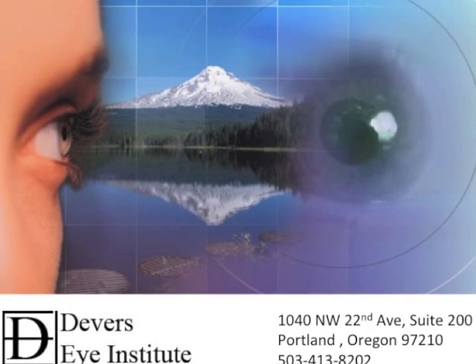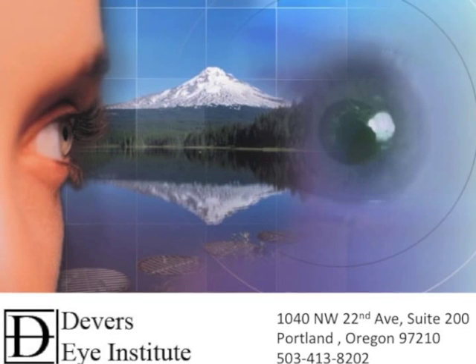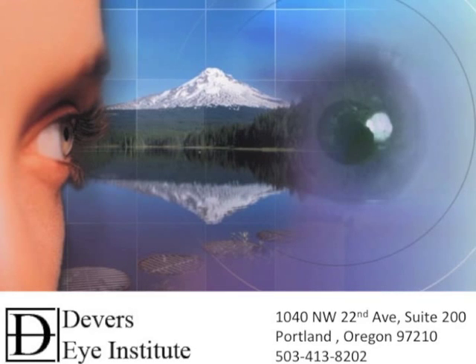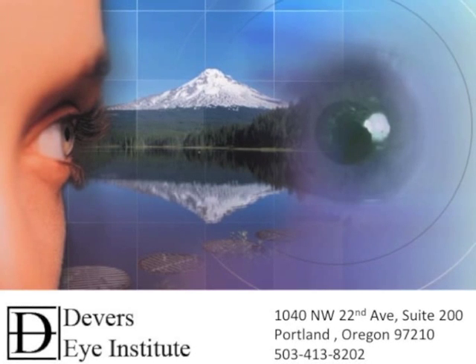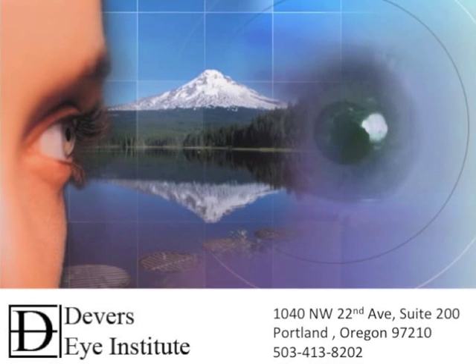Hi, this is Mike Stryko with the cornea service of the Devers Eye Institute in Portland, Oregon. I want to show you a case of a recent DMEK combined with FACO that I did. It highlights some of my recent technique changes that have allowed us to achieve a less than 4% rebubble rate that we're quite excited about and would like to share with the rest of the cornea community. I hope you enjoy the video.